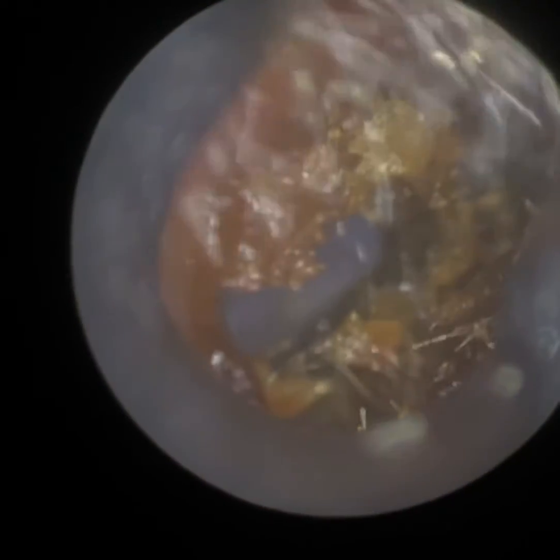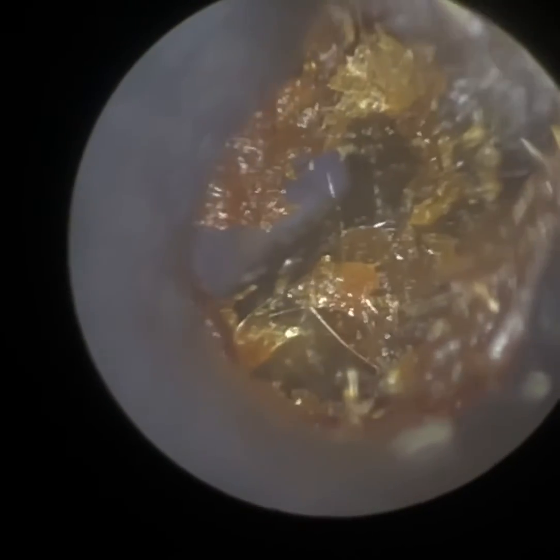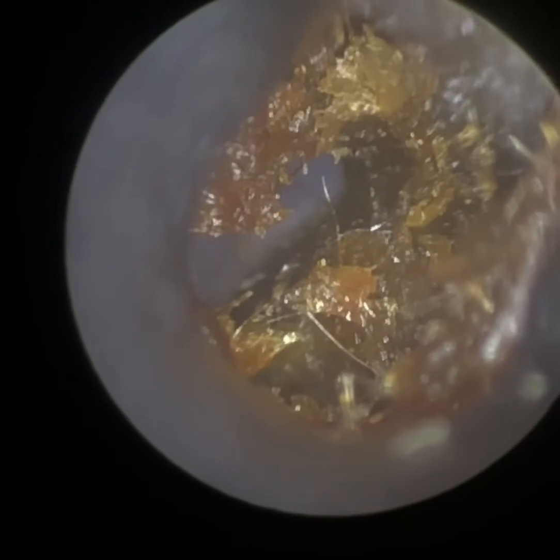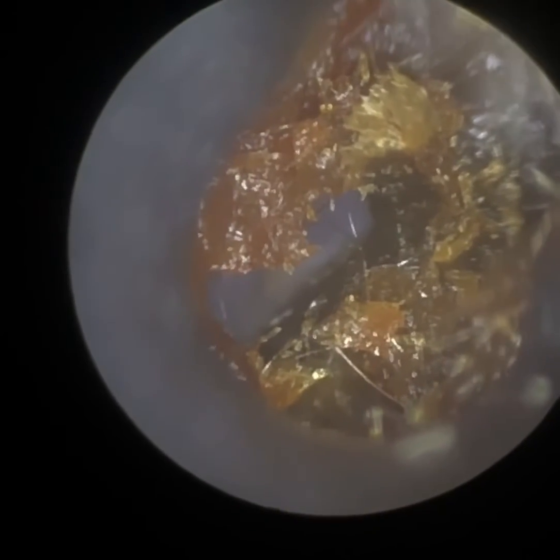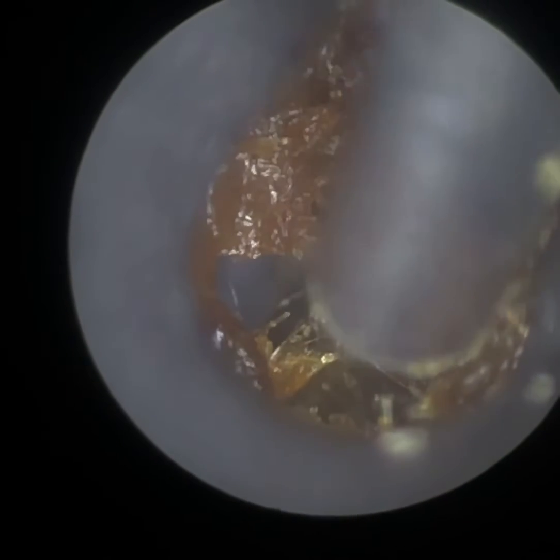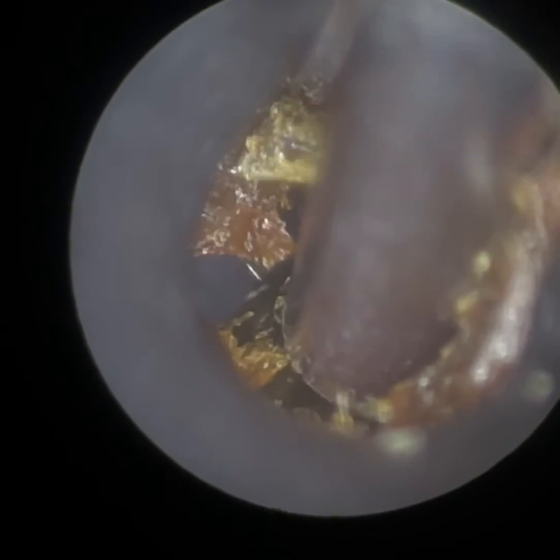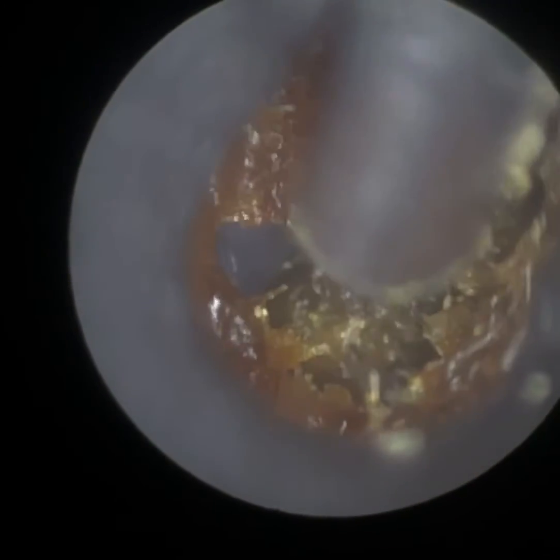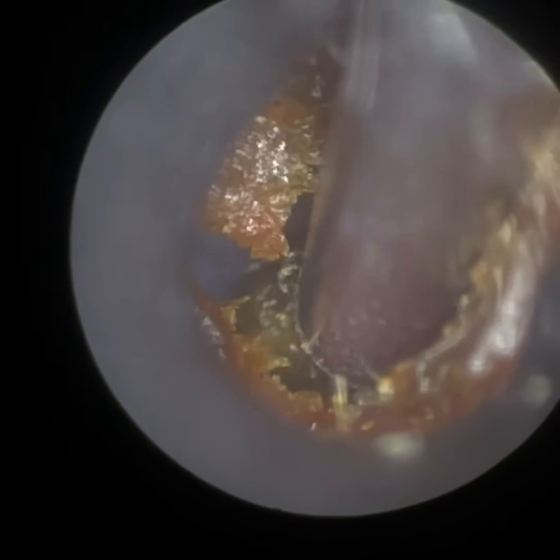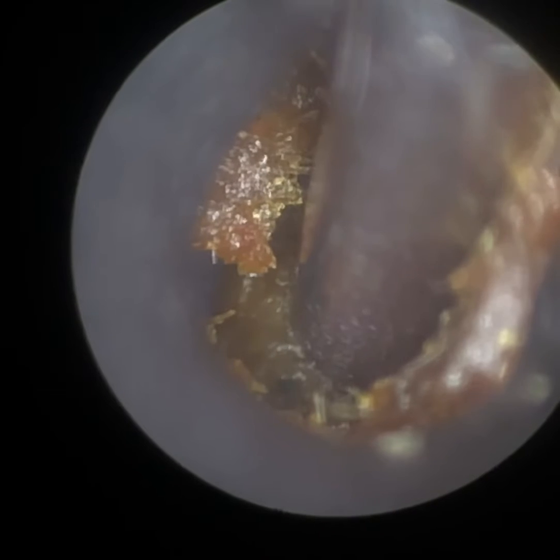The key to this procedure — because the patient is really anxious, even before I was going into their ear they were quite anxious and not really steady — is to remove this wax. If there's any peripheral, non-significant residual wax, I'm not overly concerned. You will see, once I remove this plug, there's a bit of wax around the edge. I did attempt to go back in to remove it, but the patient was just a bit too anxious, and we alleviated their symptoms.